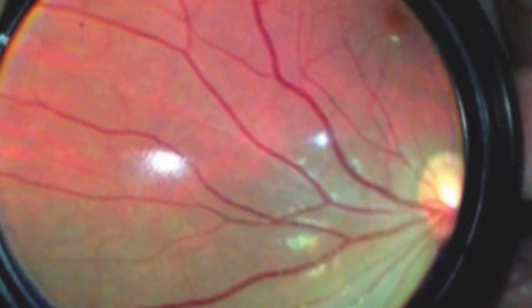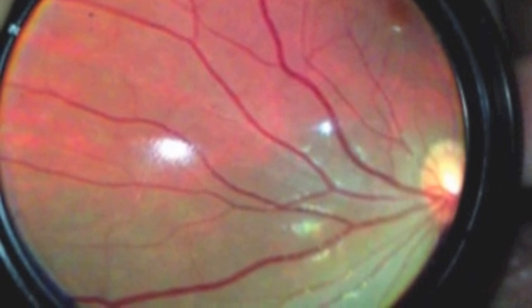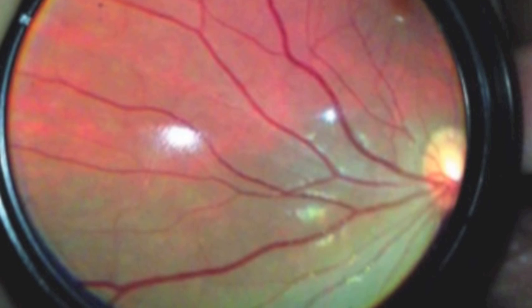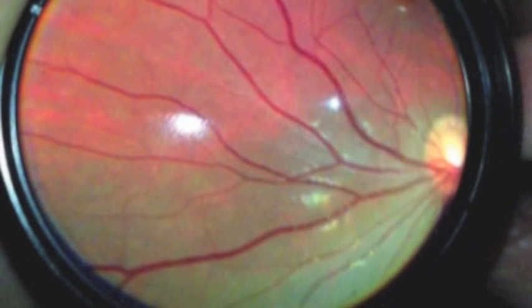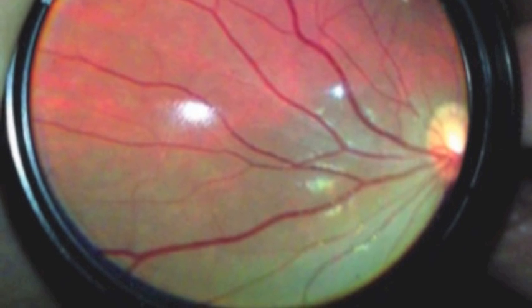To look at different parts of the retina, you must ask the patient to look in the direction of the area that you are trying to view and move your whole body to allow you to align the headset illumination and the lens. Again, when recording your findings, you must remember that the image is inverted and laterally reversed.